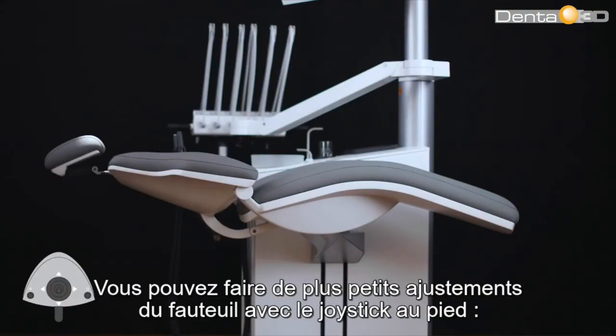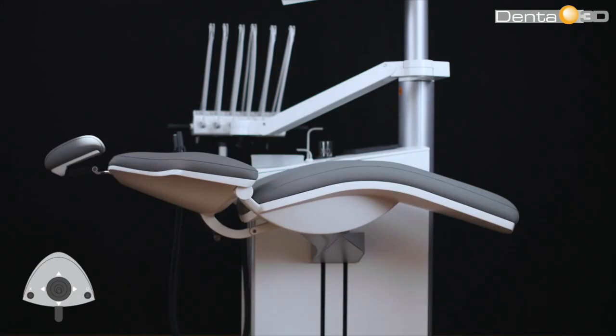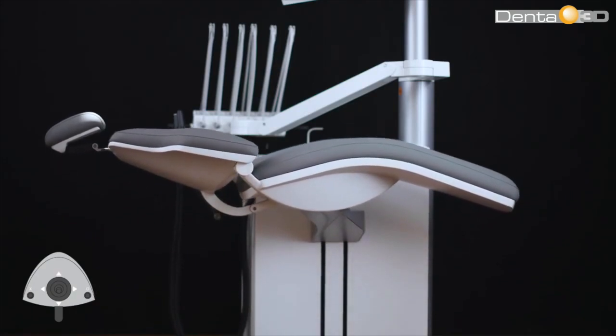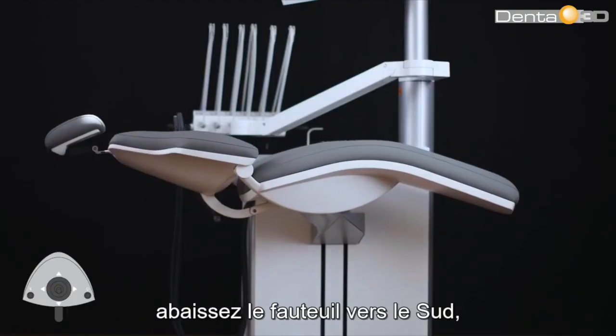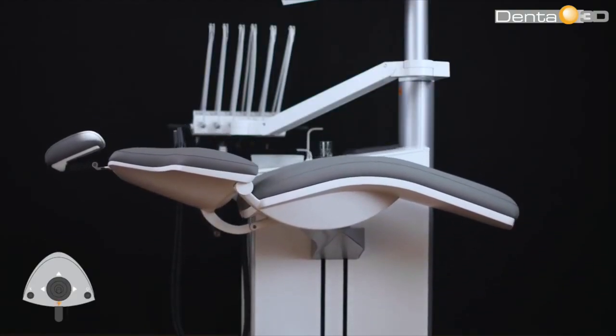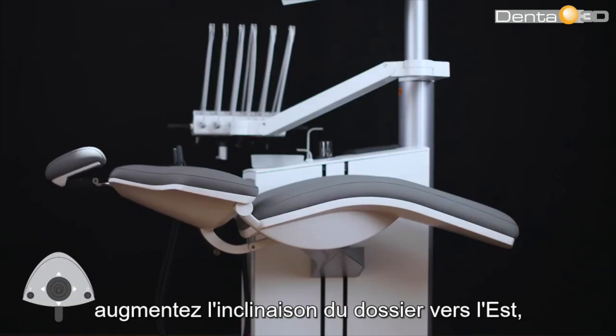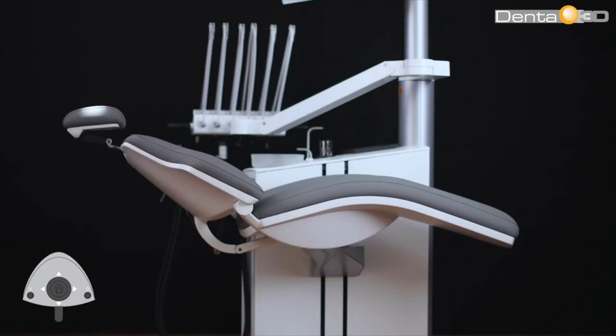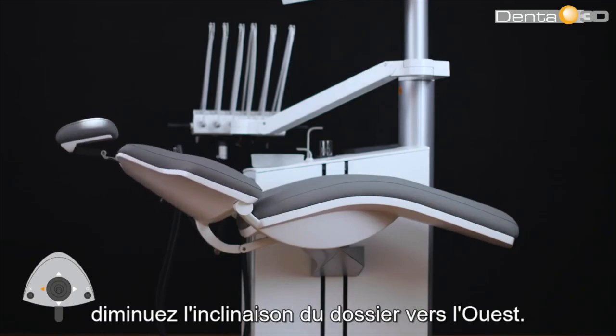You can make smaller adjustments to the chair with the foot control joystick. Lift the chair with north, lower the chair with south, increase the backrest inclination with east, and decrease the backrest inclination with west.